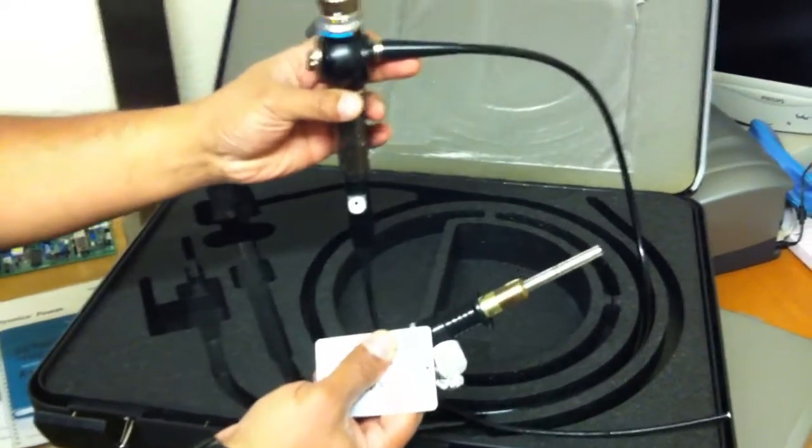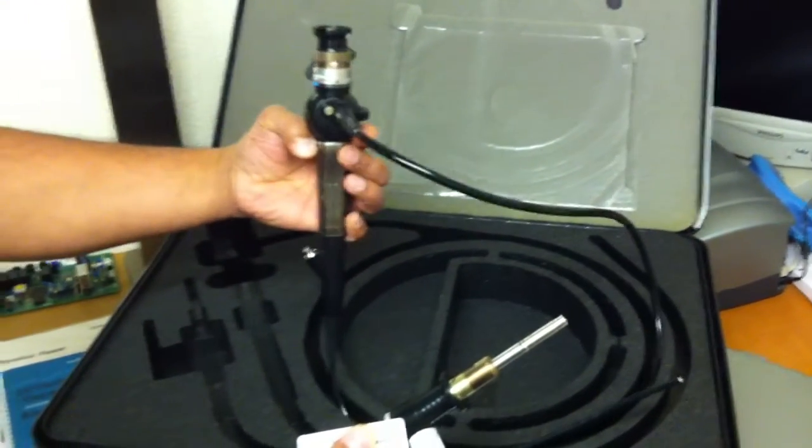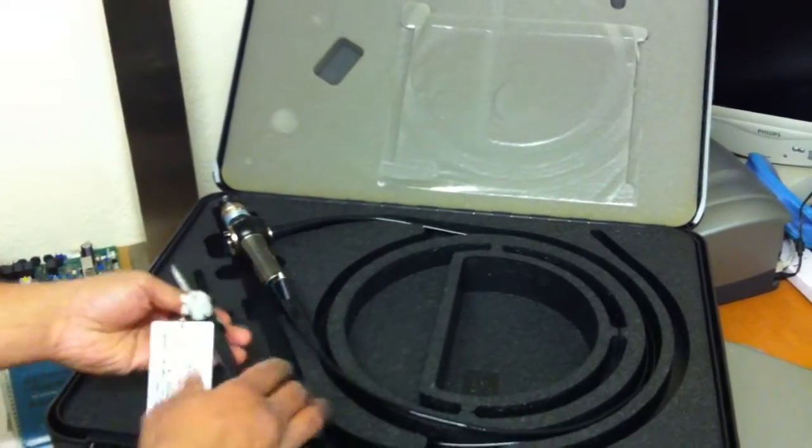We have tested these on the trolley and they appear fine. We have also tested the left. I'm going to leave this in case, to give you an idea what they need.